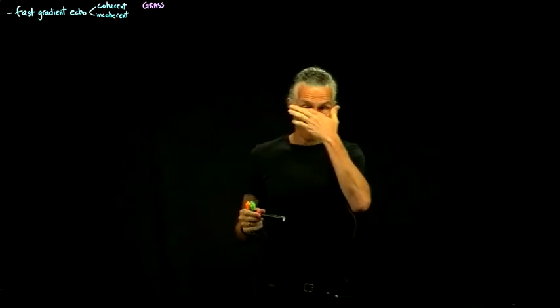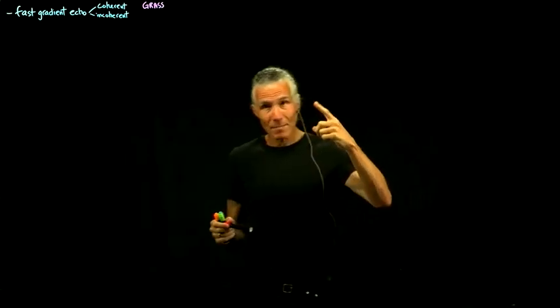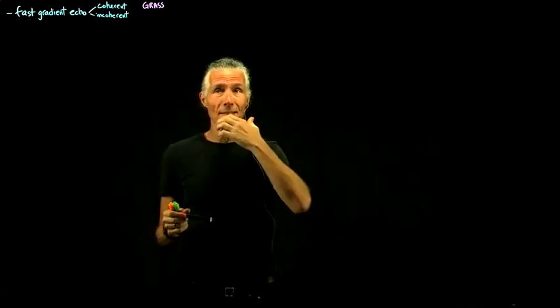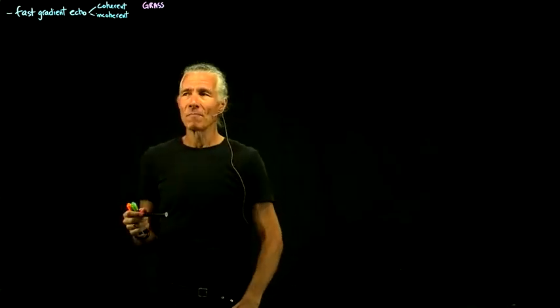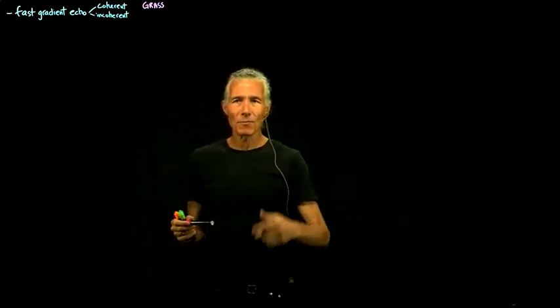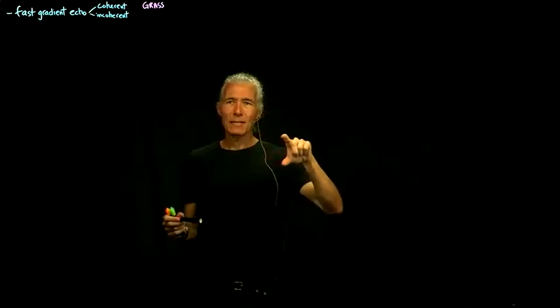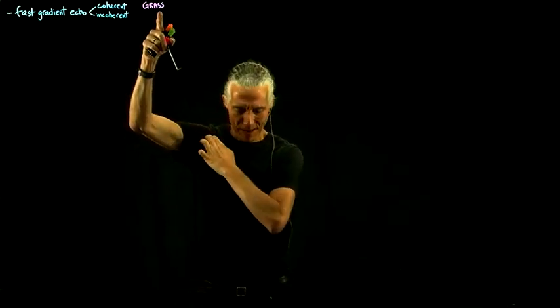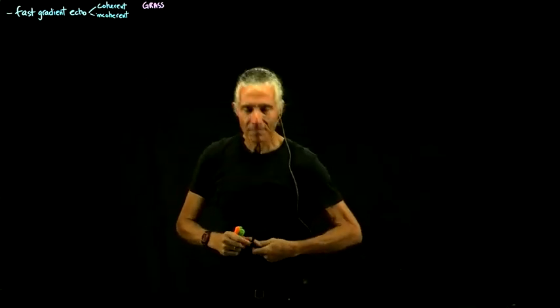So you remember when we talked about imperfect 90-degree flips, you have to do several of them until you get to a steady state. Well, the same thing happens with fast gradient echo. It takes a little while to get to the steady state, but then you're in the steady state. So you'll see a lot of SS for steady state in there.